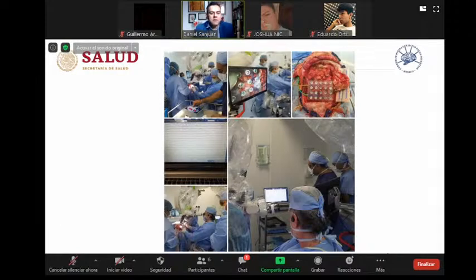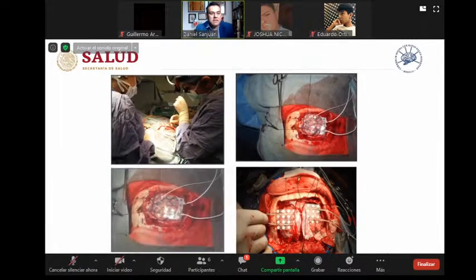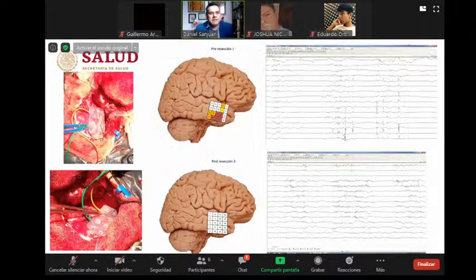And now stereo-electroencephalography is emerging, and it's possible to implant it for the presurgical evaluation, similar to what you see at the beginning with Dr. Penfield, to decide which is the area more affected. And you can see now one patient in the resection 1 and 3, and the lesion, the localization of the grids, and the presence of the spikes.